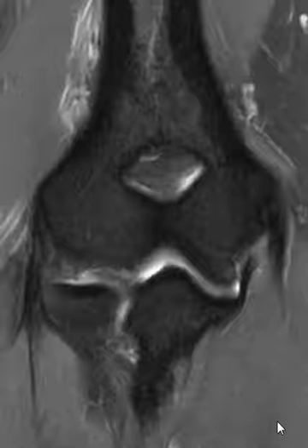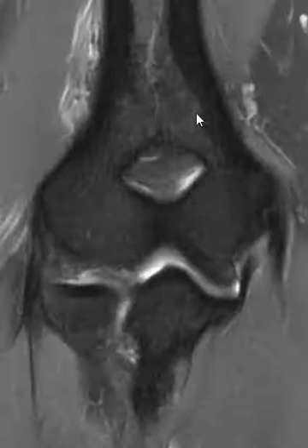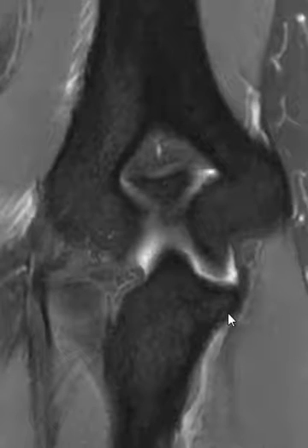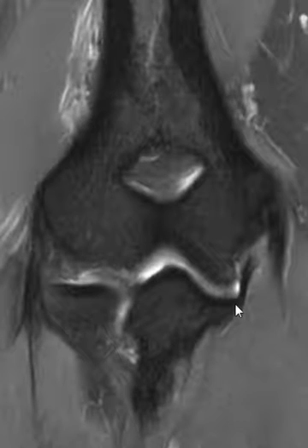He had chronic ulnar-sided pain. This is a view of his elbow looking straight on. This is a fat-suppressed T2 sequence, so fluid is bright here. We see the ulna — this is the ulna — and the little pointy part along the edge here is called the sublime tubercle.